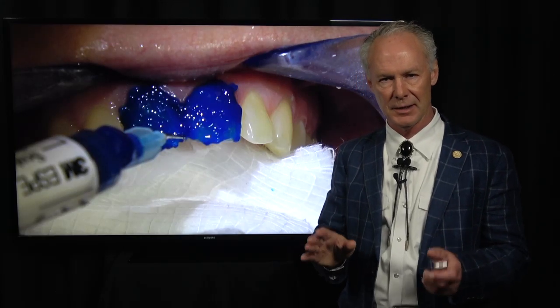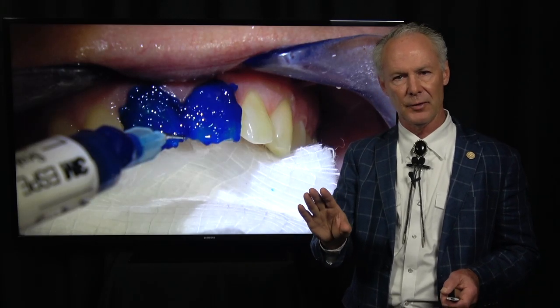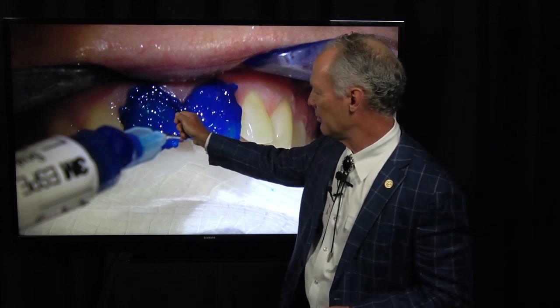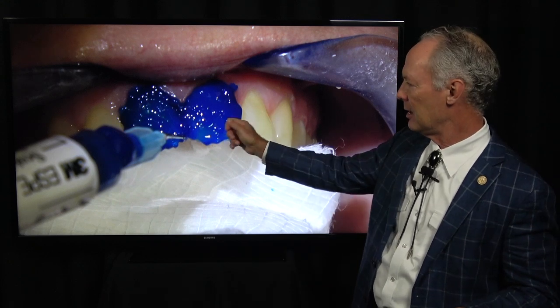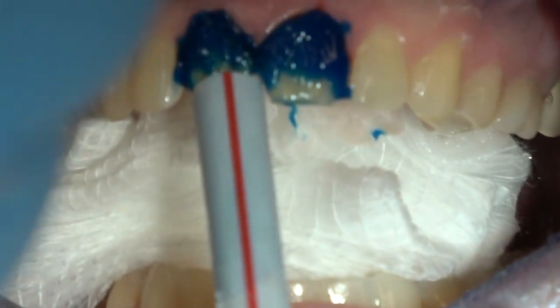If you have dentin exposed, there's no limit to how long you can etch enamel, but you only want to etch dentin for about 15 seconds. What you would do: put the etch on the enamel first and on any bleeding areas of the gum, leaving it for about 30 to 45 seconds. Then come back and put etch on the dentin for only about 15 seconds. Then rinse it all off with ice cold water from a bottle with a large tip so you don't put too much pressure on it.